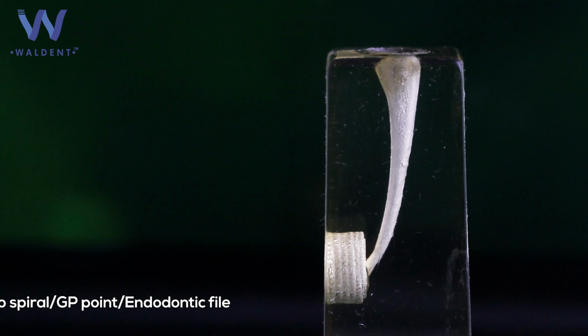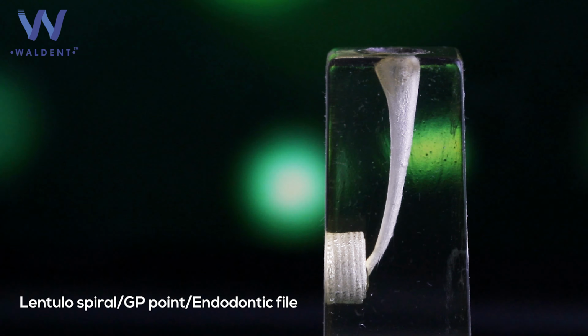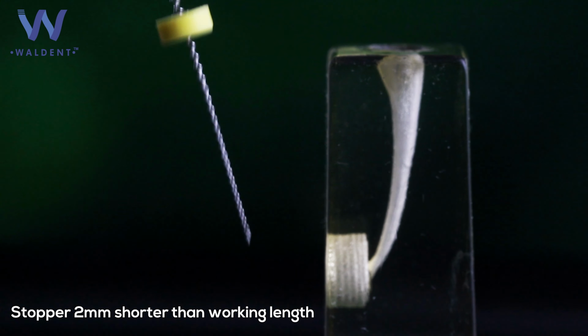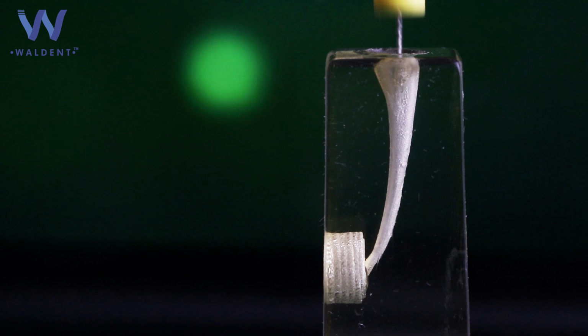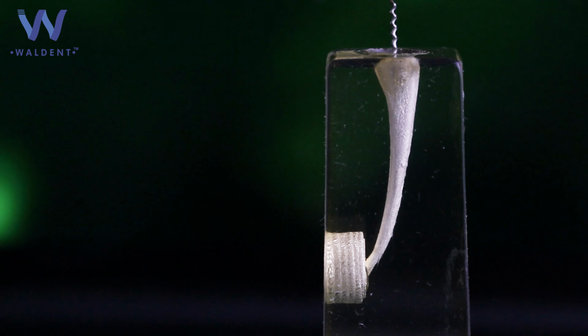Use a Lentulo spiral, gutta percha point or an endodontic file for applying calcium hydroxide into the canal. While using the Lentulo spiral for calcium hydroxide placement, adjust the rubber stopper 2 mm shorter from the working length. Make sure that the Lentulo spiral is not binding into the canal and is moving freely.